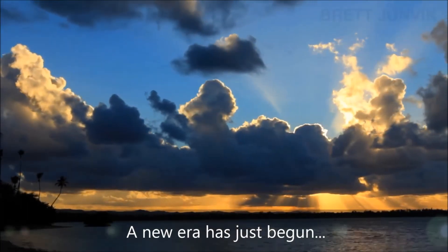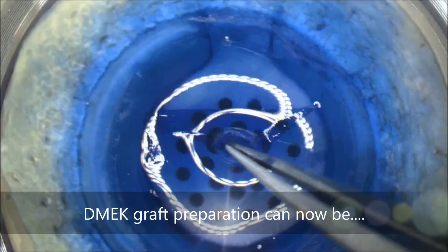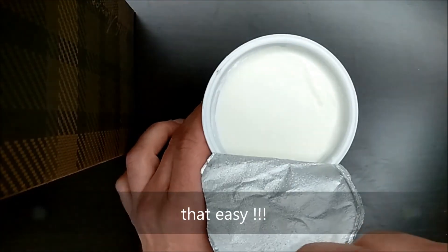A new era has just begun and it's upon us to decide how we move further. DMEK graft preparation can now be... that easy.